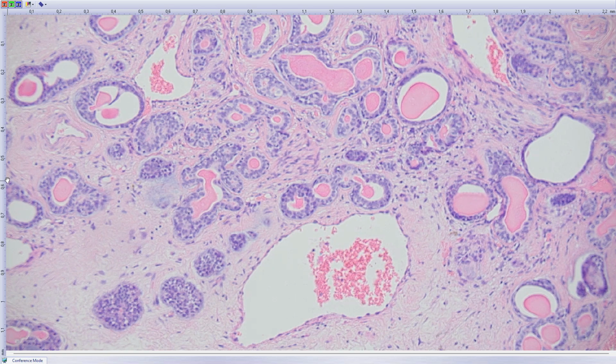And the main tumor that appears like that is adenoid cystic carcinoma. So we are submitting 31 cases of adenoid cystic carcinoma arising in seromucinous hamartoma. When it appears, we will send you a reprint. Okay, I will give the word to someone else.